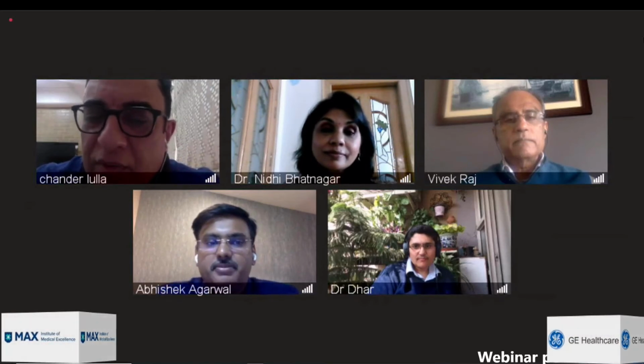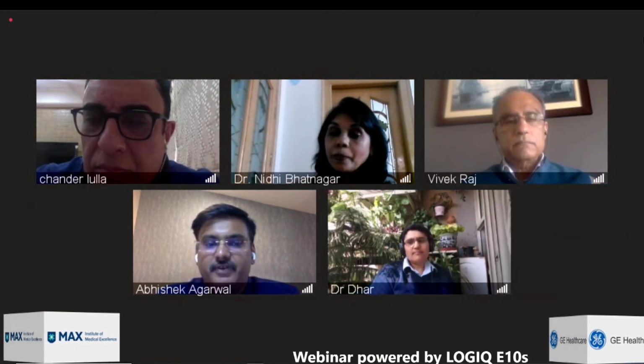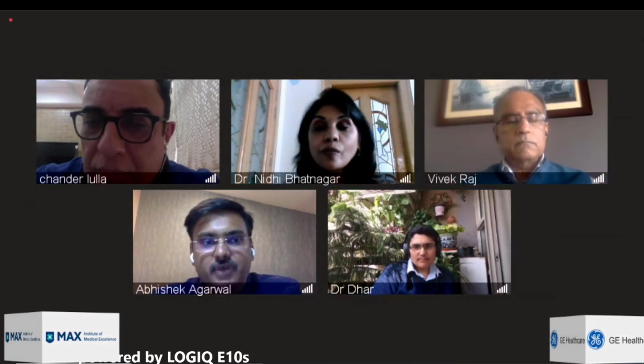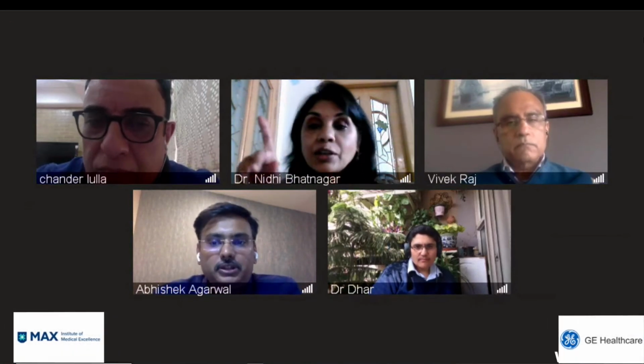So that's an important point for the audience, because if the values come out normal, what non-fasting can do is probably give erroneously increased values. It can't give erroneously reduced values. So if the values are coming normal.